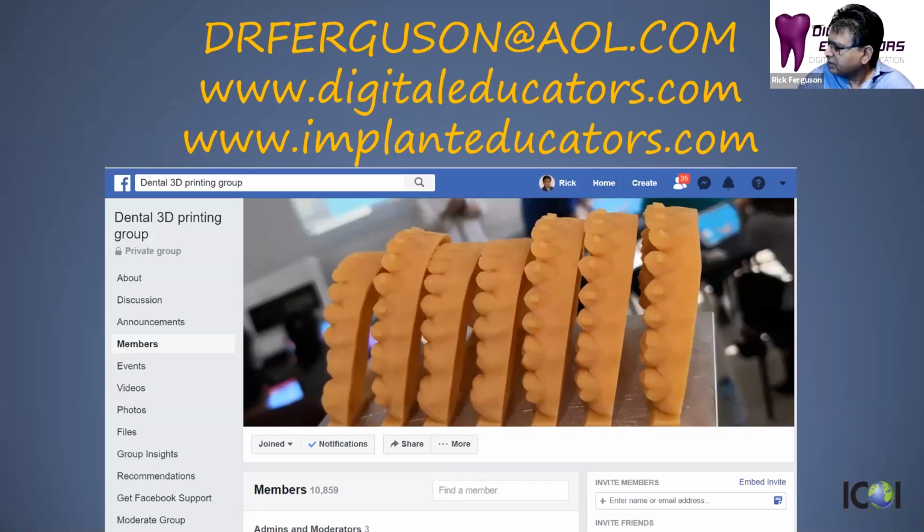In our practice, we actually have a medium field of view Carestream 8100, which has been a great machine. We've had it for over 4 years now, and I love the image resolution on it. It's got a very high resolution. It's great for looking at fractures or endo issues in teeth as well. But it's just enough to do these full arch guides that I'm doing.